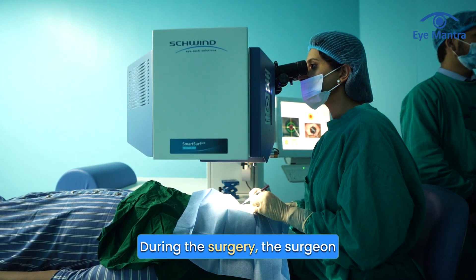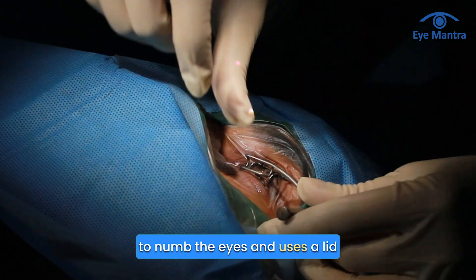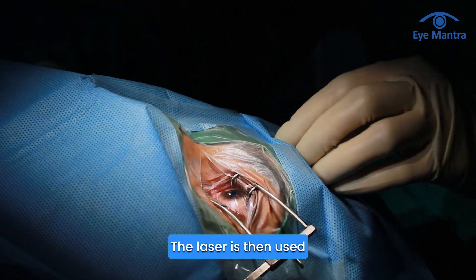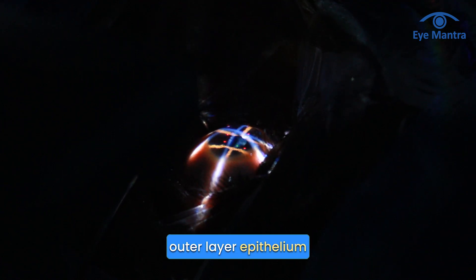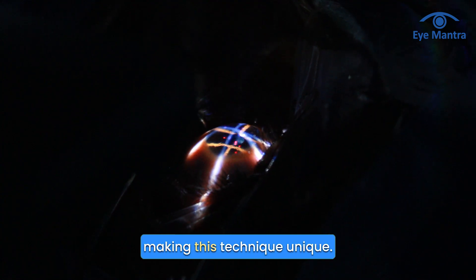During the surgery, the surgeon applies anesthetic eye drops to numb the eyes and uses a lid speculum to keep the eyelids open. The laser is then used to gently remove the cornea's outer layer, the epithelium, without any physical contact, making this technique unique.